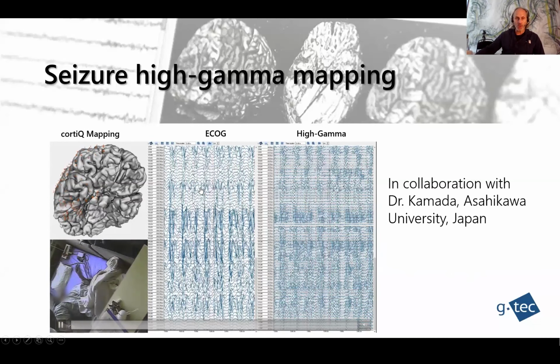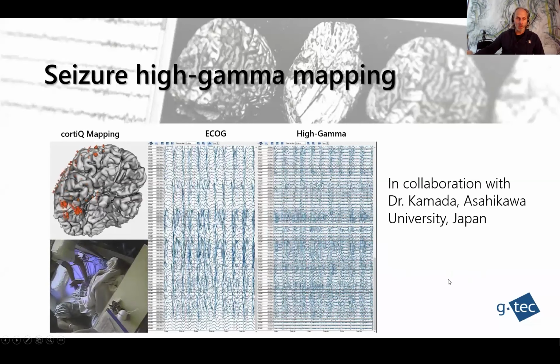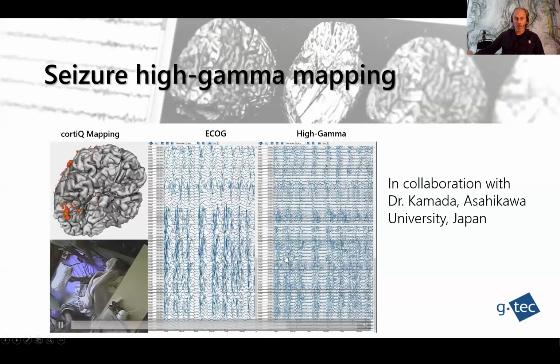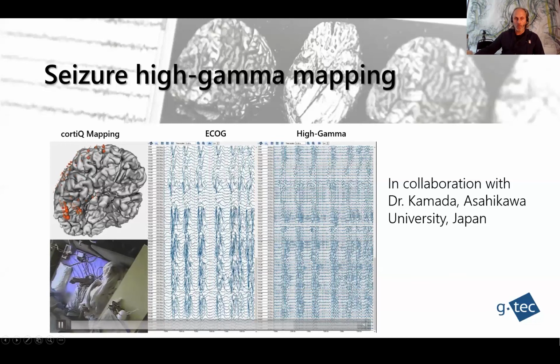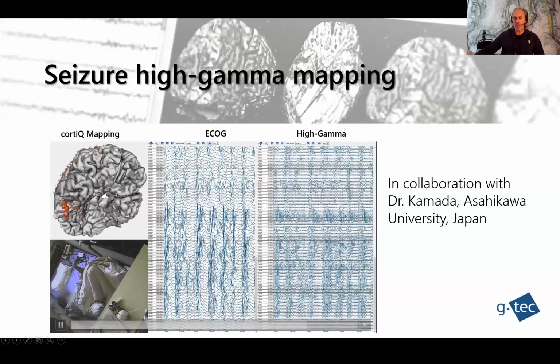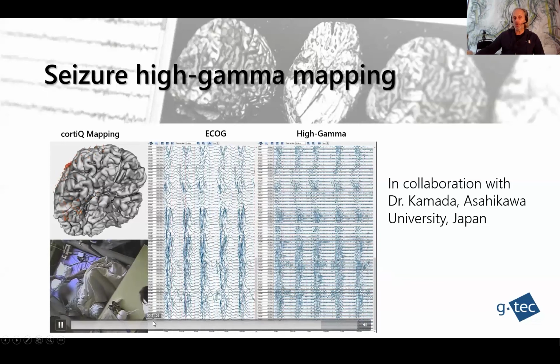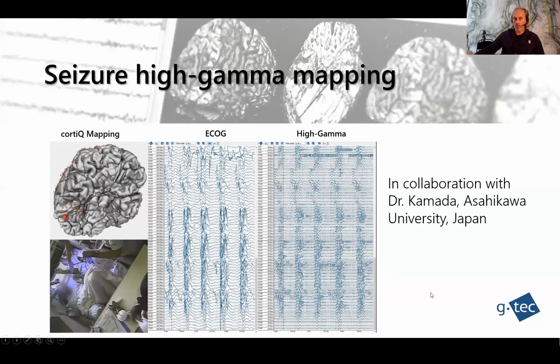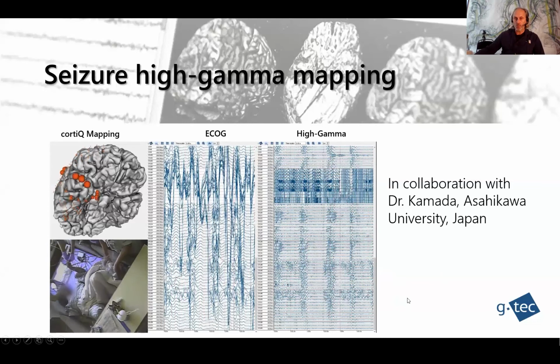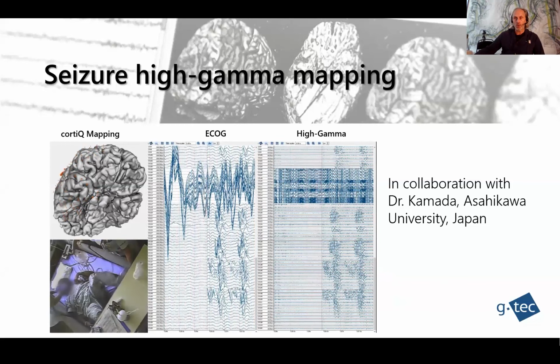Now you can see the seizure is all over in the ECoG signal and also in the high gamma mapping signal. And it takes some time to come down again. With this tool, it's just much easier to understand how a seizure spreads out compared to only an ECoG recording signal that hospitals normally use. Now you can see it gets more silent. Patient is stabilized.